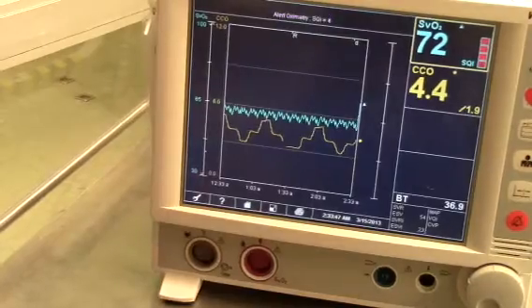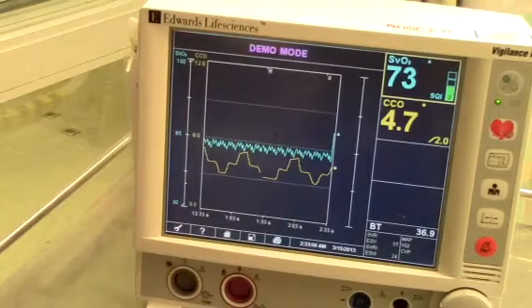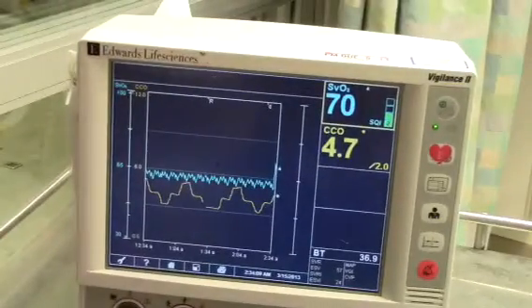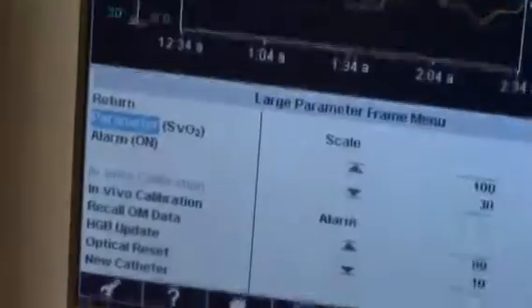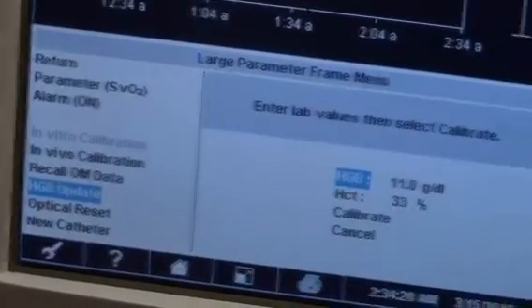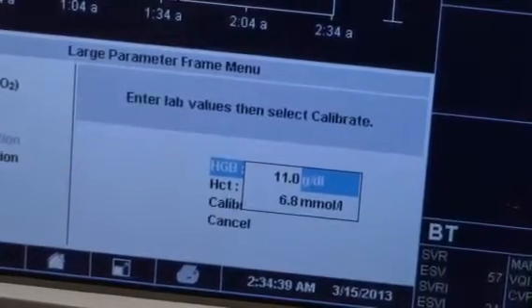How to perform a hemoglobin calibration or update when there is a significant change in patient hemoglobin hematocrit levels — such as patient bleeding with significant blood loss or the patient receiving a large amount of blood transfusions, for example 3 PRBC transfusions, where the previous hemoglobin was 7 but is now 10. To begin, navigate the knob to highlight the SVO2 or SCVO2 parameter frame. Select and press hemoglobin update. Enter the new hemoglobin result and select Calibrate.